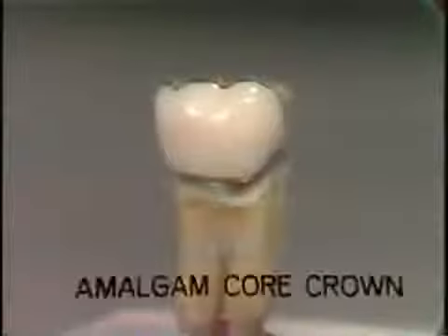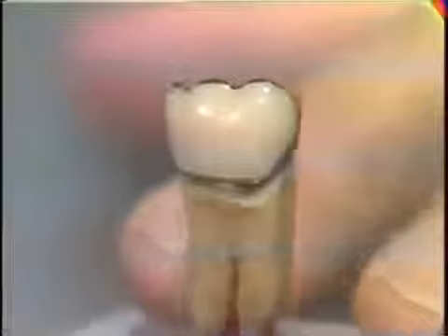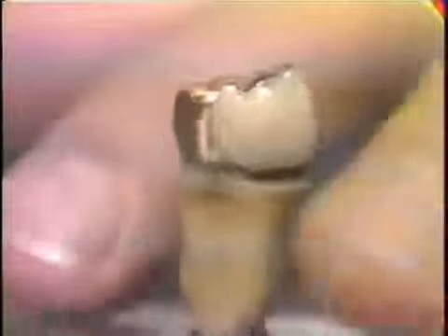The example which I have on the bench here shows an amalgam core crown which has been restored with an acrylic veneer crown. Looking at it now, you see a labial buccal facing of acrylic resin and a gold occlusal and gold lingual surface. It looks just like any veneer crown.